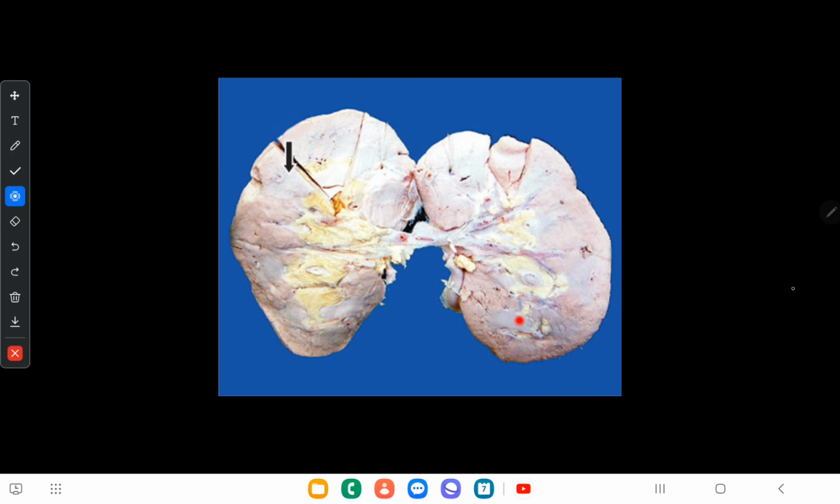In this video we will discuss amyloidosis. Amyloidosis means deposition of amyloid proteins in tissues and organs. Proteins can be deposited in various tissues and organs, causing a variety of problems. Here you can see amyloidosis in a kidney.